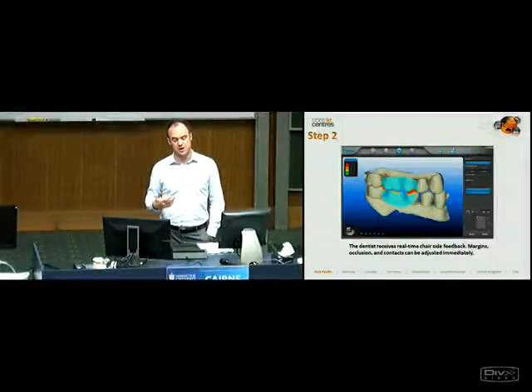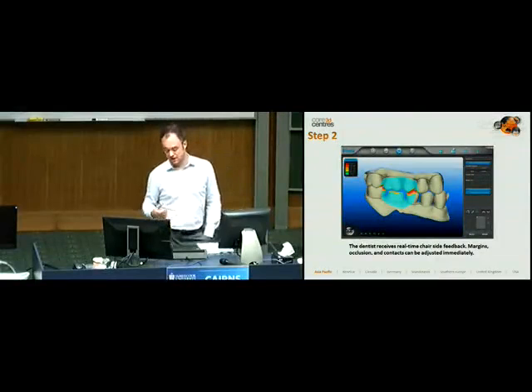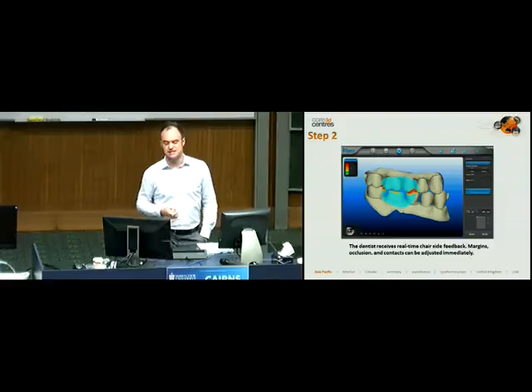Clearance very, very quickly and easily. And obviously you can see other things to do with the bite and occlusion, which is powerful. And you also find that the patients are a little bit more engaged because they don't really understand an impression. When I first got into dental, it took me a long time to get my head around what an impression was and why it was necessary. We take it for granted every day now, but for a patient it's hard for them to comprehend.